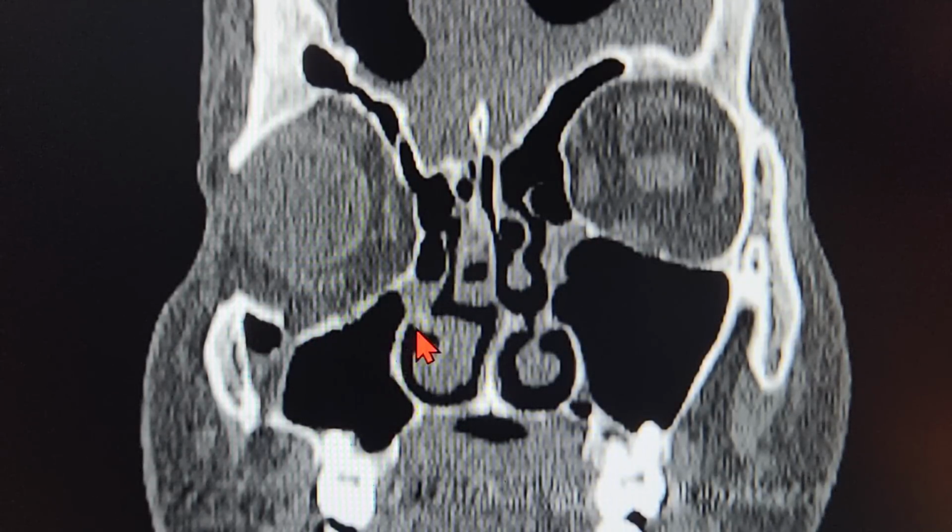So once you open the patient's maxilla, you may see that the floor of the orbit is very, very low, but it doesn't make any sense to repair this floor of the orbit right now at this particular surgery, because it's been 10 years and the patient does not have any issue with the right side eye. So you just have to expose it. There's no compulsion to treat this floor of the orbit right now, unless the patient has enophthalmos, and if that's the case, you can get it done, but not right now.